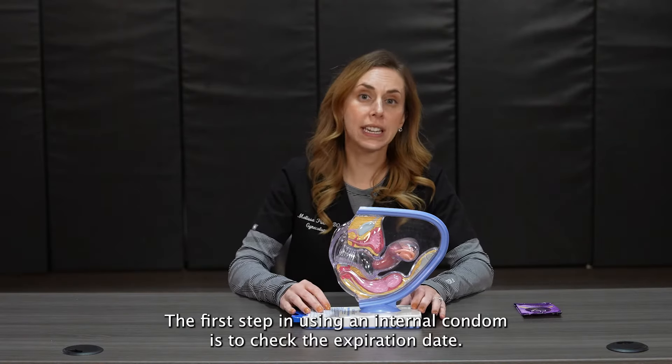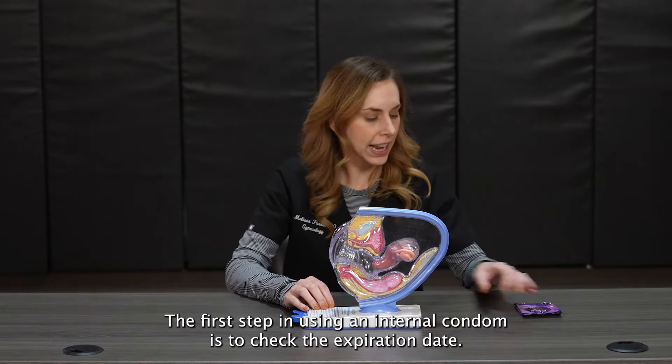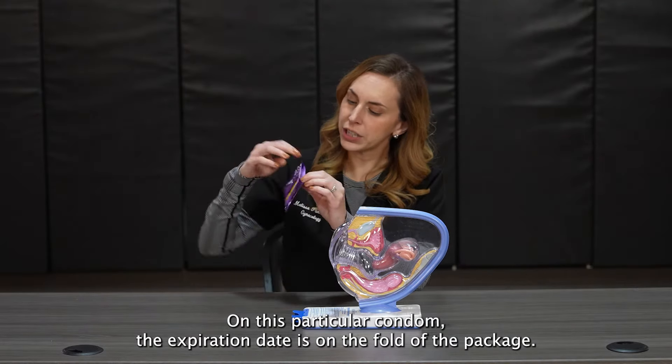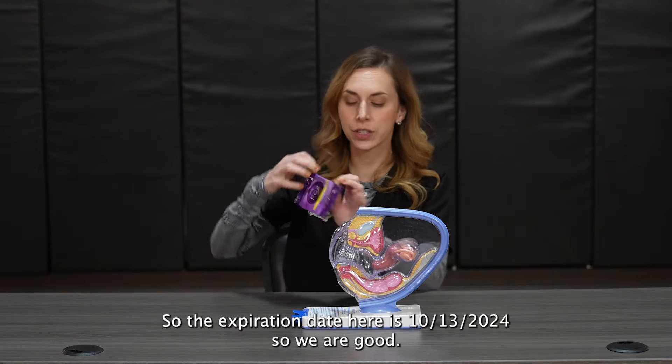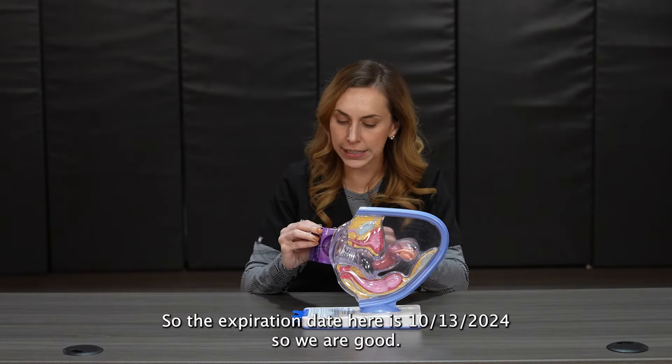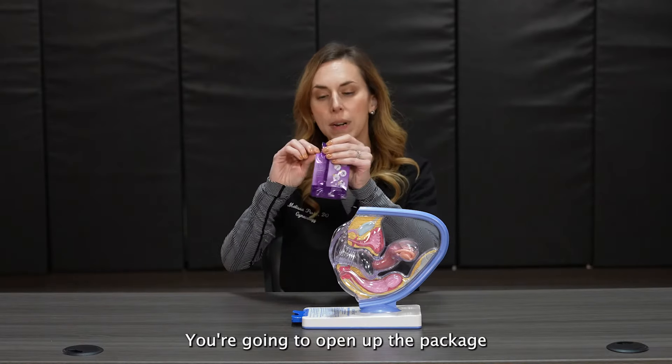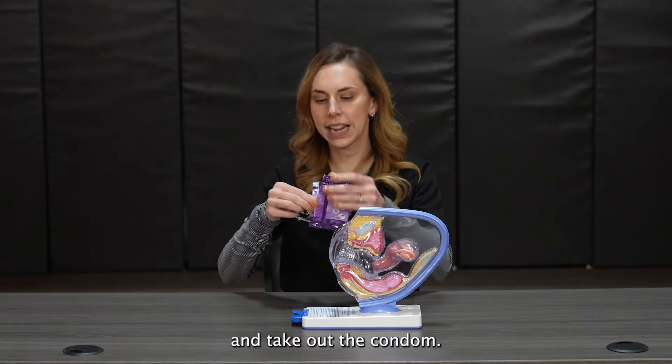The first step in using an internal condom is to check the expiration date. On this particular condom, the expiration date is in the fold of the package. The expiration date here is 10-13-2024, so we're good. You're going to open up the package and take out the condom.